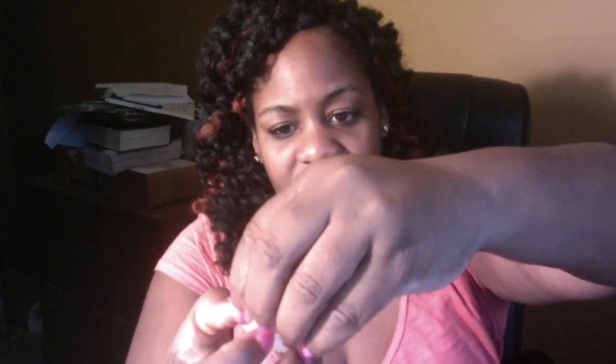So this is basically a condom. You can see it, and just like a condom, you put it on regularly. Kind of roll it. And this is the part which we did not do. We did not do this part. It's funny, I haven't used a condom in a while. So, yeah, this is a condom, and just like any other condom, you just roll. Continue rolling up until you get it on. So this is basically it.